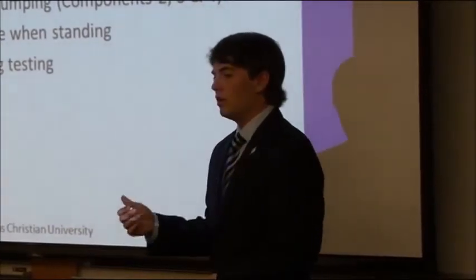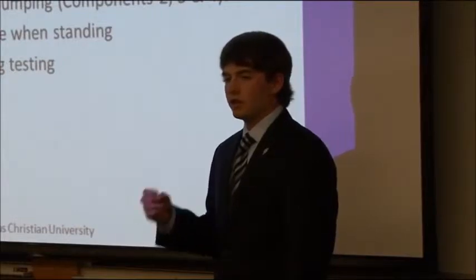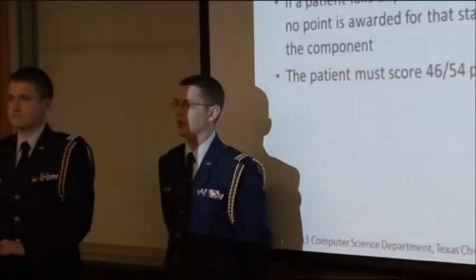And also we need to know what leg is currently on the ground so that we know that the leg we're grading is on the ground and not in the air, and is at the time that it should be graded. The scoring for this test was based on criteria provided by Dr.